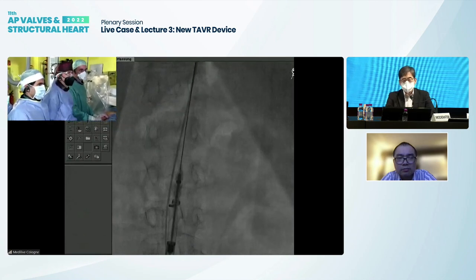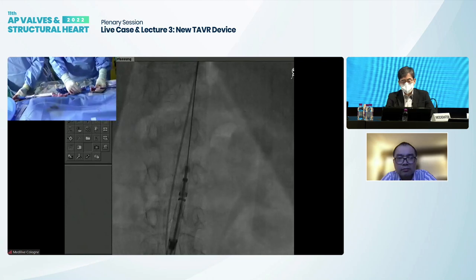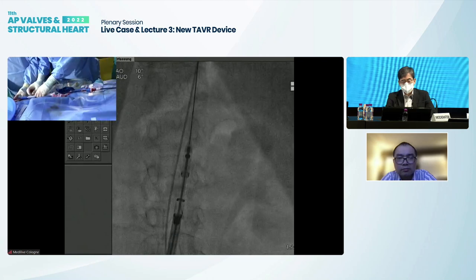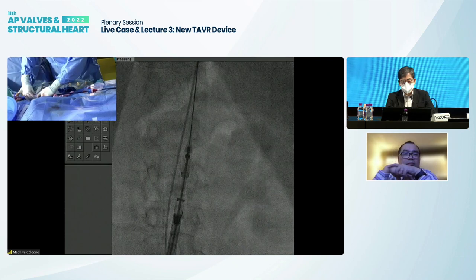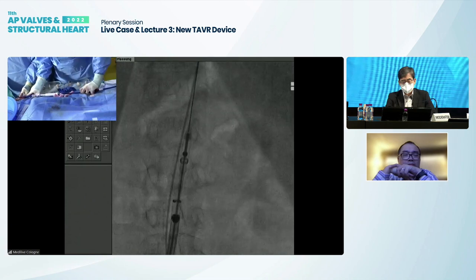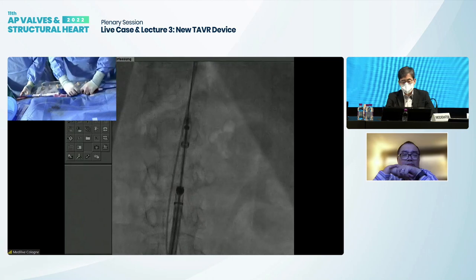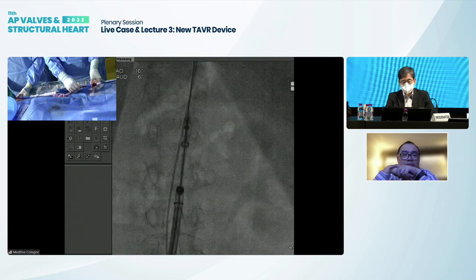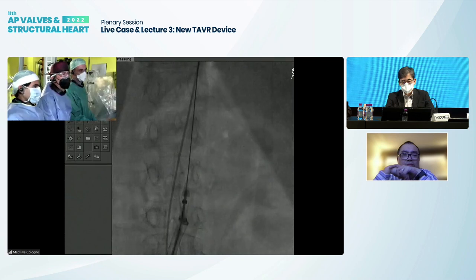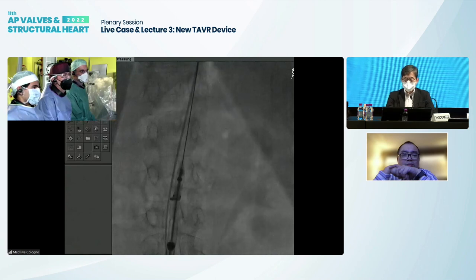Yeah, it's a very important question. It's simply the clipping mechanism. It's not relying on the fact that there is radial strength. It's just the clipping mechanism. That's why you have to be so careful in getting all cusps covered with the locators. Here we have apparently a little problem getting the system.